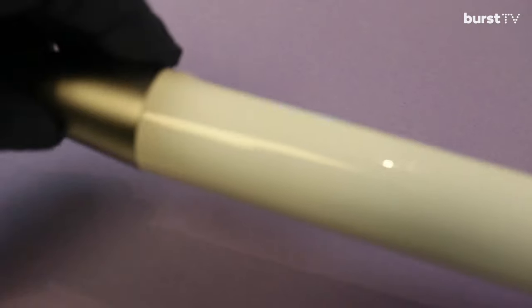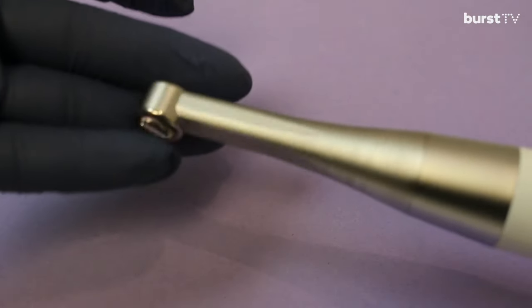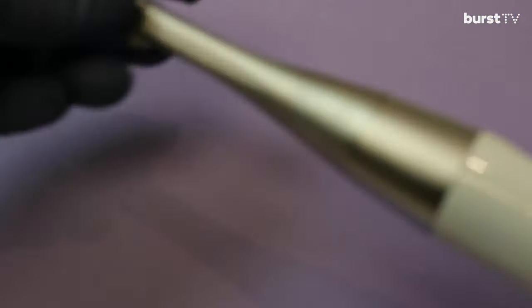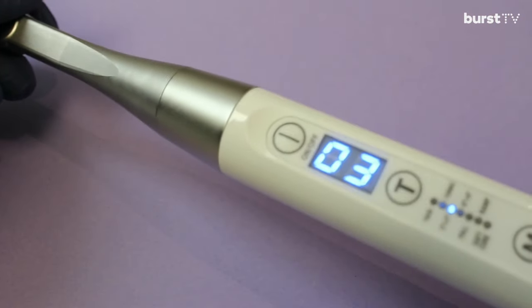All right, so the materials that you need for a good sealant is, of course, the sealant, and you need an etch. So the etch is a type of acid that dehydrates the tooth. It opens up those pores, it opens up the grooves. That way it makes the sealant a lot easier to seep in and adhere to the tooth, so it acts as an adhesive. And then, of course, you're gonna need your curing light. It's actually going to shine on the sealant and harden it so that the sealant is not going anywhere.